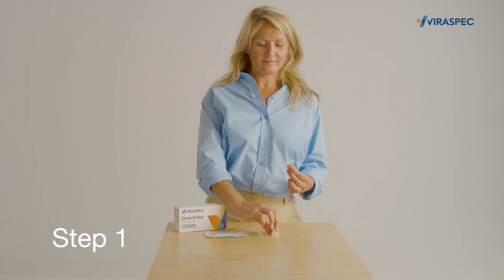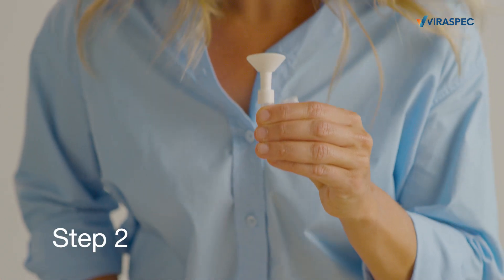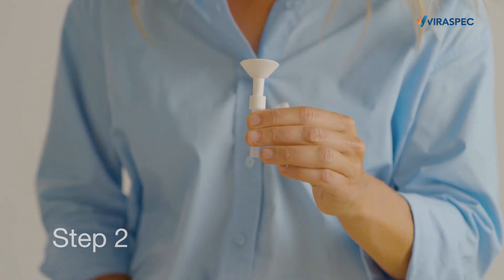Step 1: Put the saliva collector on top of the collection tube. Step 2: Spit into the tube up until the second line.